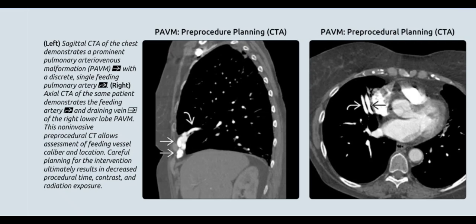Axial CTA of the chest demonstrates a prominent pulmonary arteriovenous malformation with a discrete single feeding pulmonary artery. Axial CTA of the same patient demonstrates the feeding artery and draining vein of the right lower lobe PAVM. This non-invasive procedural CT allows assessment of feeding vessel caliber and location; careful planning for the intervention ultimately results in decreased procedural time, contrast, and radiation exposure.